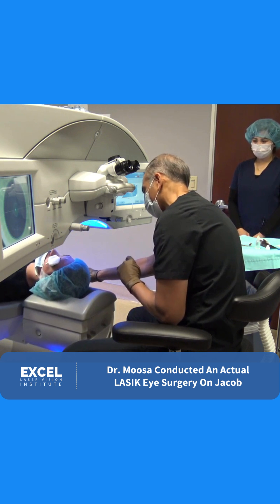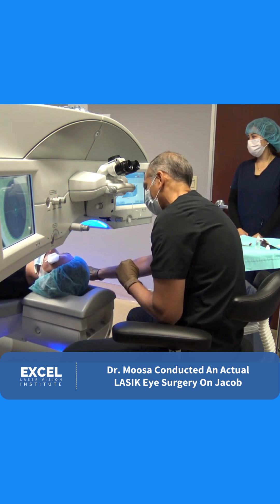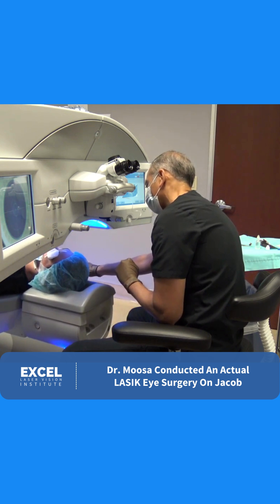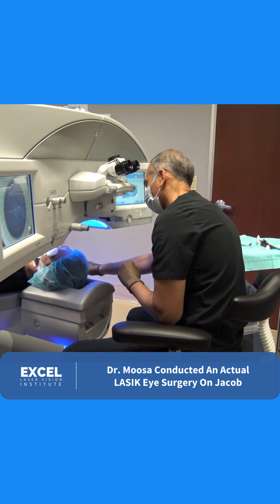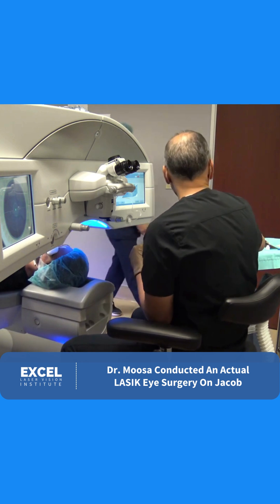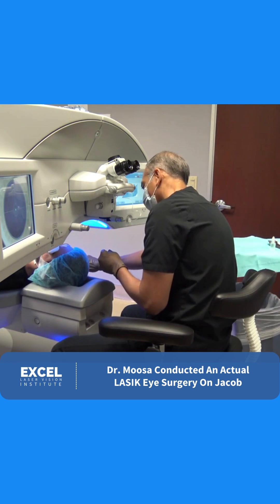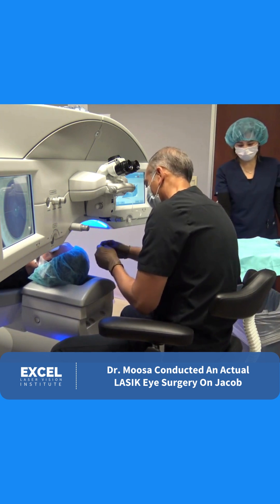You're just in perfect position. I'll give you a countdown so you know exactly how to proceed, and it will give you a good sense of how you can help yourself get through this very comfortably. The good news is that this is a very comfortable process — it's more of a light show. This is the reason why we like all this fancy equipment.